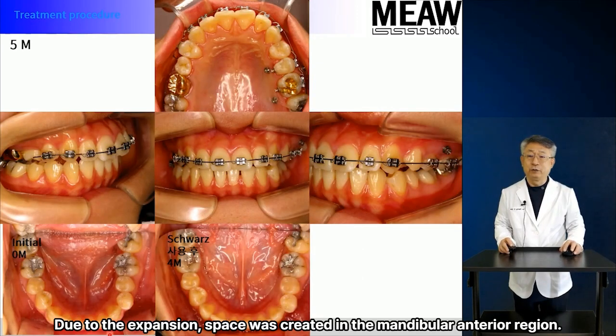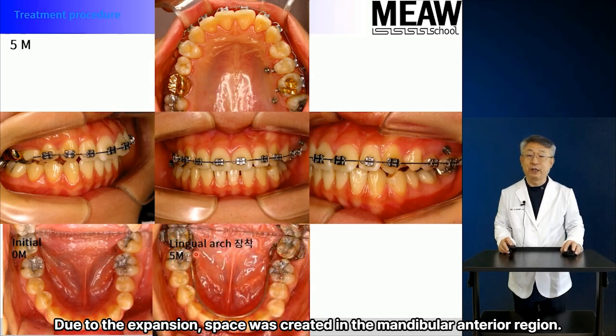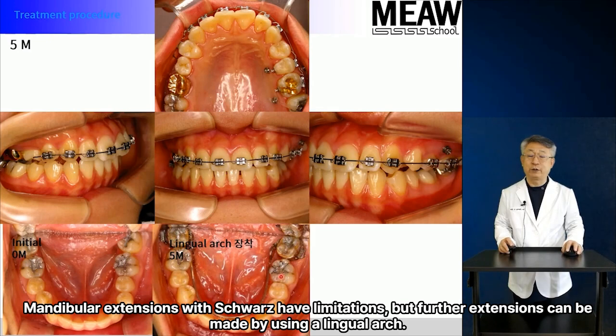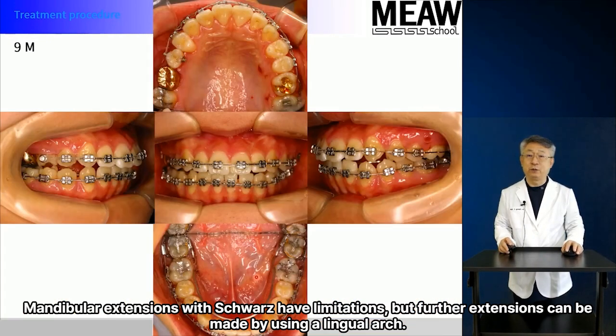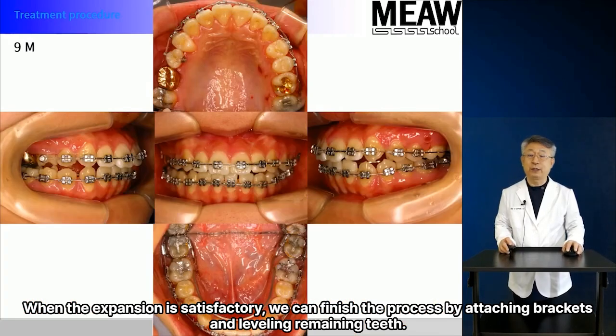Due to the expansion, space was created in the mandibular anterior region. Mandibular expansion with Schwartz has limitations, but further expansion can be made by using a lingual arch. When the expansion is satisfactory, we can finish the process by attaching brackets and leveling remaining teeth.